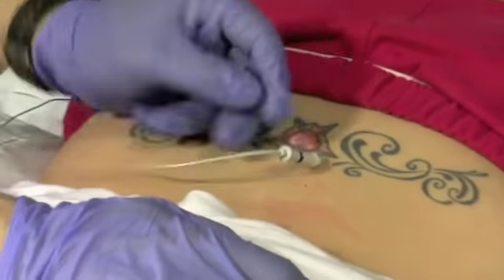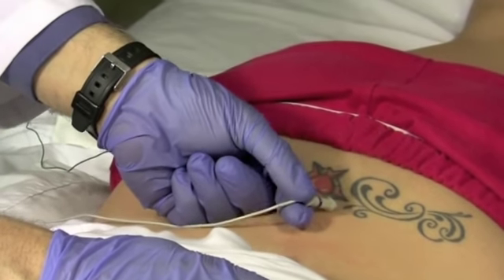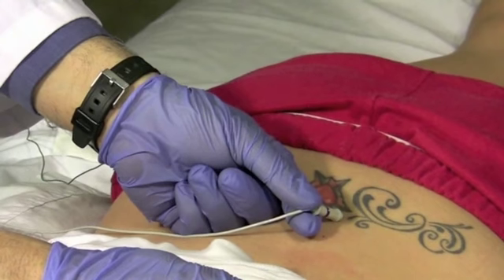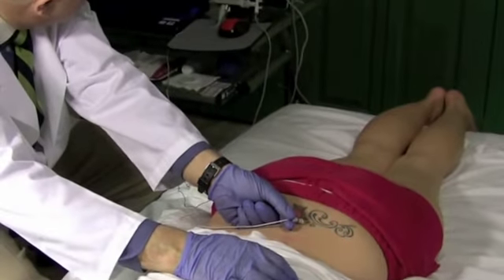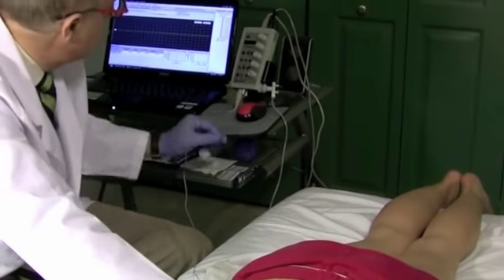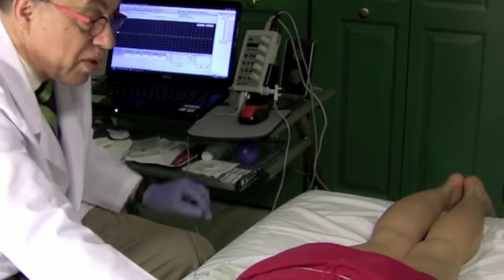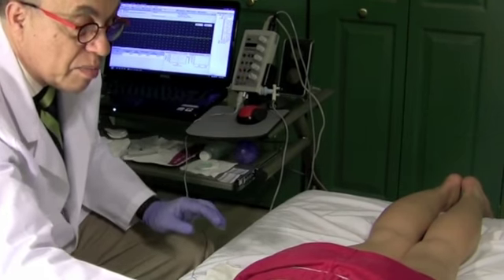You need both hands to make sure the subject relaxes. Again, insertional activity, and absolutely no abnormal insertional activity, no fibrillation and positive waves. And I'm done with the lumbosacral paraspinals.